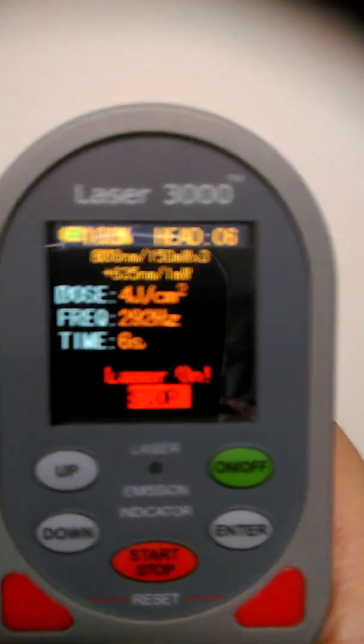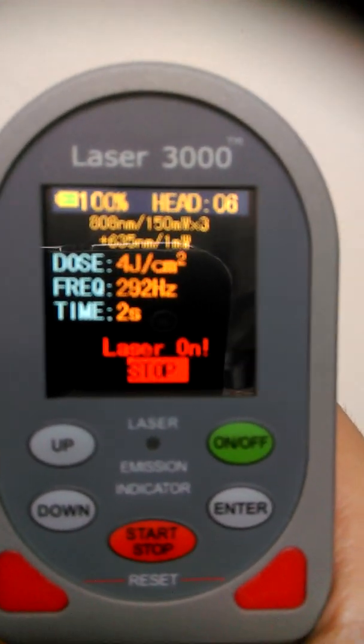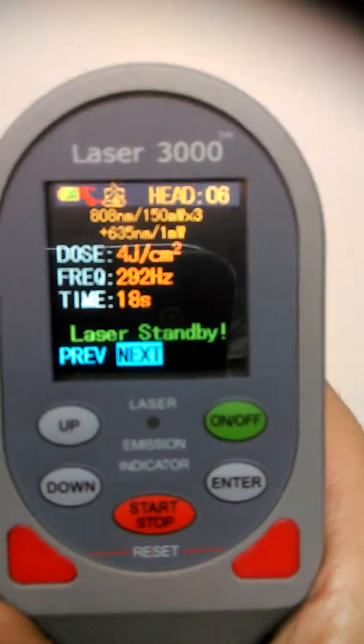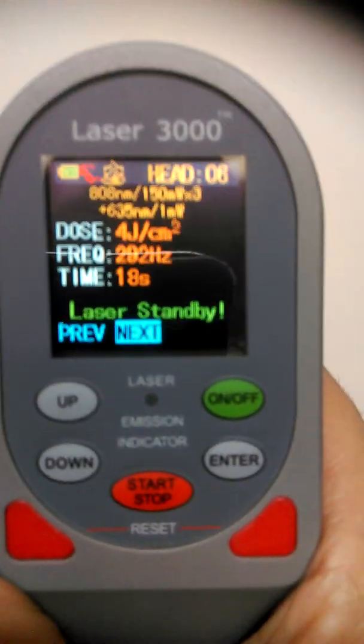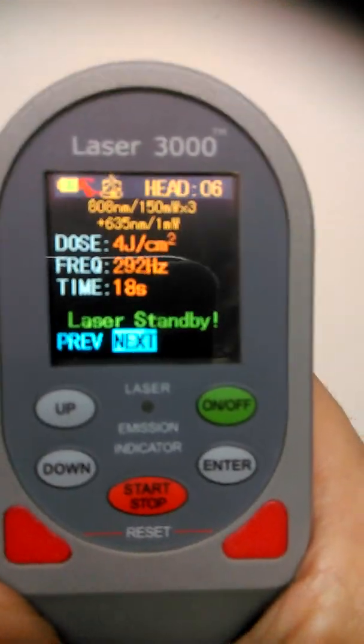The cluster head 808 nanometer Laser 3300 comes with 450 milliwatts, making it a very powerful handheld unit. The 3300 is a portable, powerful, professional, programmable unit that is ideal for treating injured greyhounds — tendons, muscles, ligaments, and more.